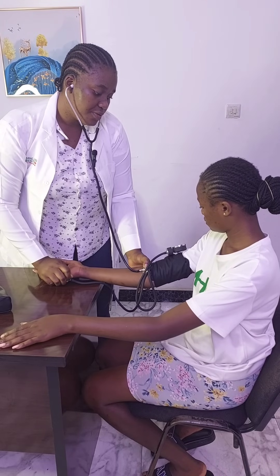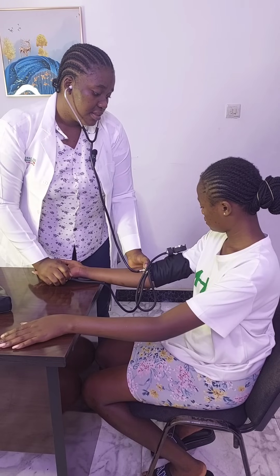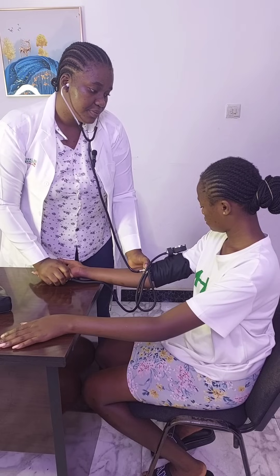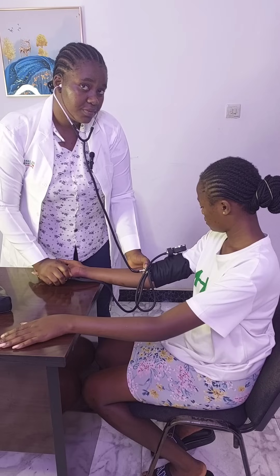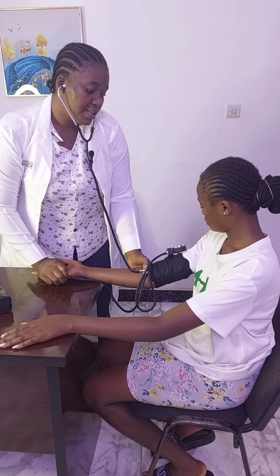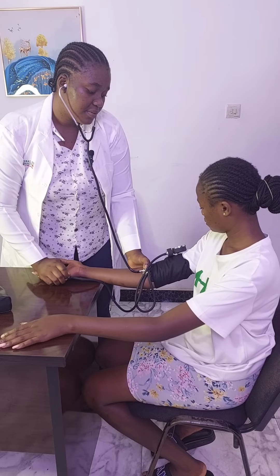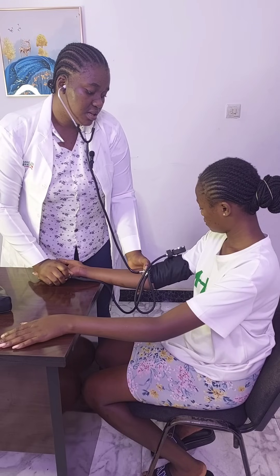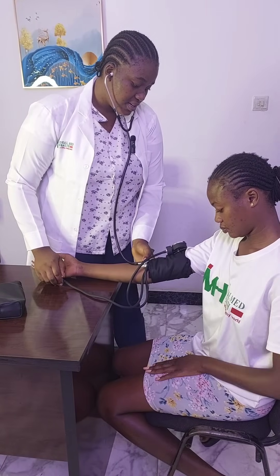Like my colleague, who I'm using as an example — the number I got as the systolic pressure is 140. You record this as your systolic pressure, which is the upper number. You deflate further until the pulse disappears — that's the diastolic pressure. I'm getting 70 as the diastolic pressure.